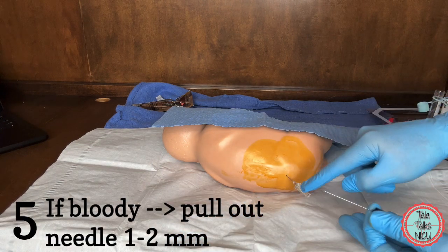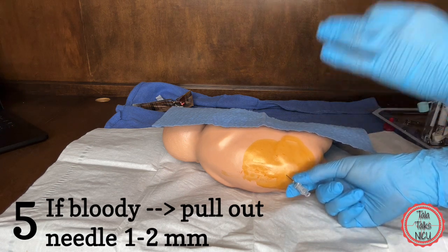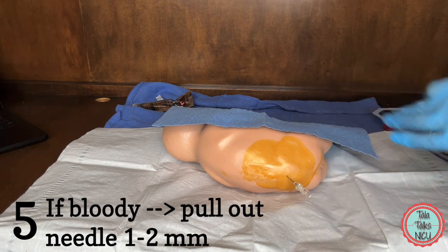Five: there is blood dripping out but it doesn't seem to be clearing up. Most likely you're in too far. Pull the needle out just a little bit and see if that helps.